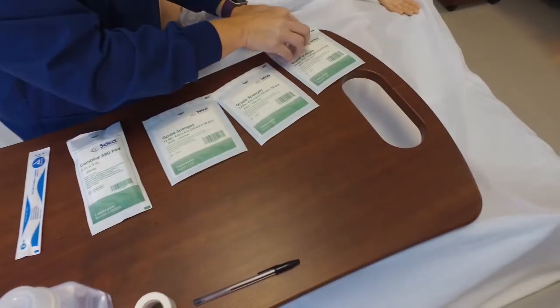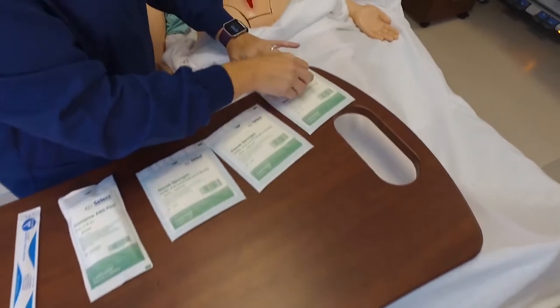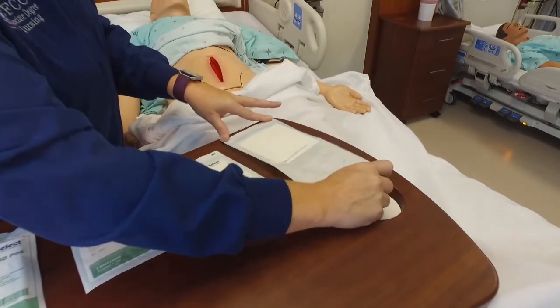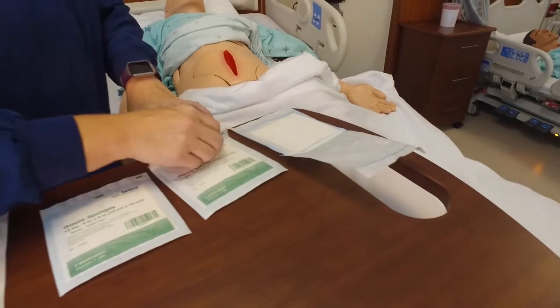She will open the packages away from her and be careful not to reach over the sterile fields. In this case, each package is a separate sterile field.